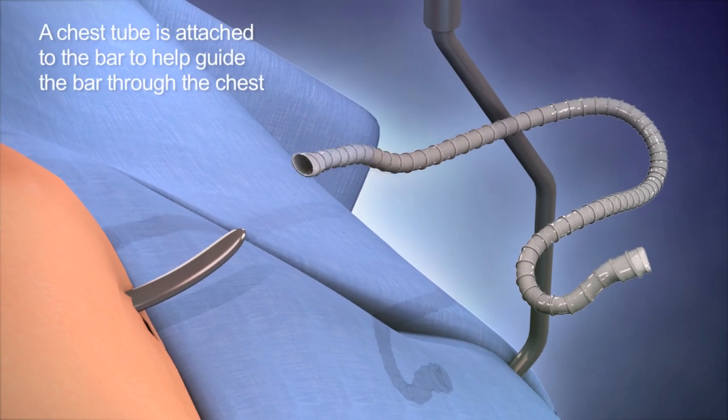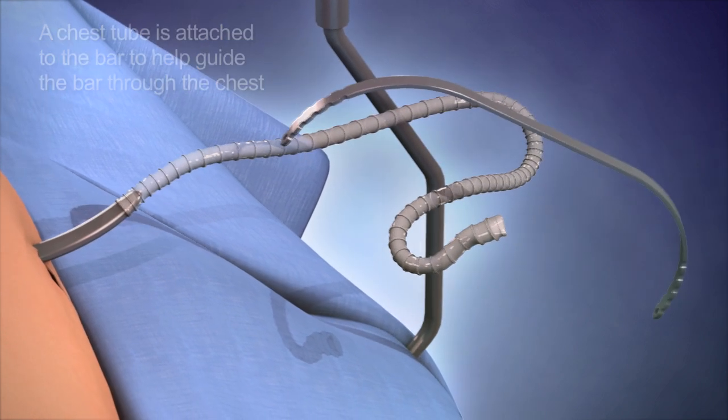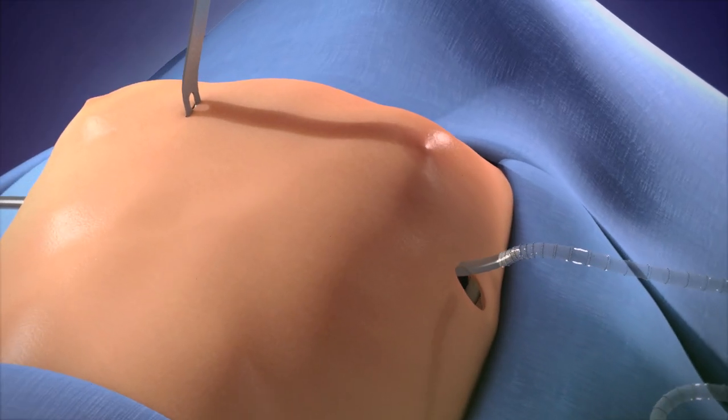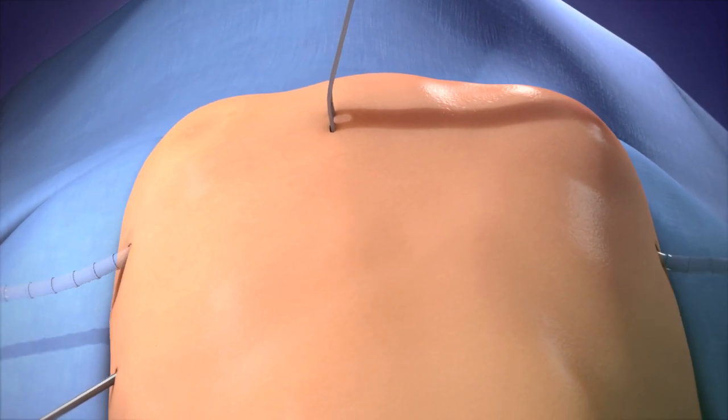Next, a chest tube is attached to the tunnelling instrument and to the bar being used to correct the deformity. The tube and bar are pulled through the incisions, all while ensuring the bar is away from the heart.